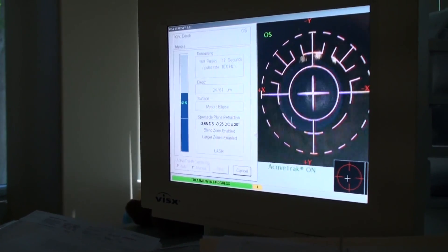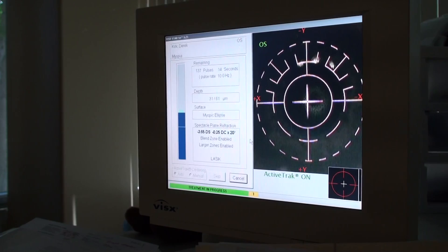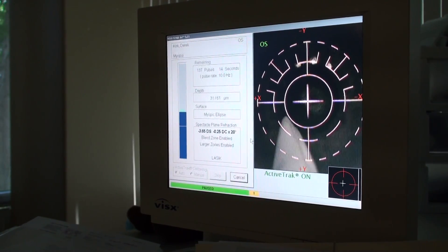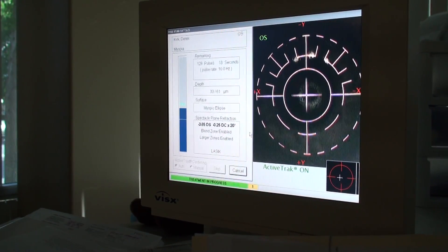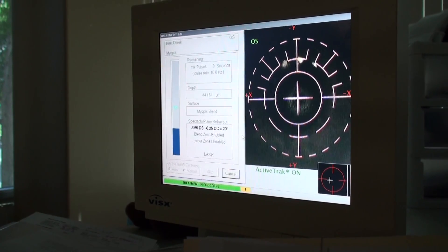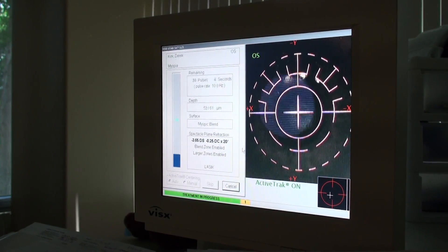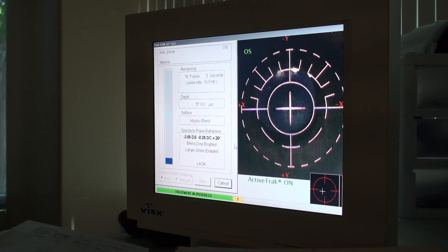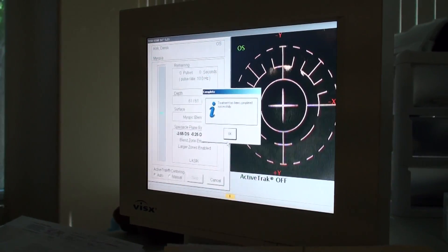20 seconds... changing. 10 seconds... changing. 5 seconds. And your treatment is complete. Wonderful.